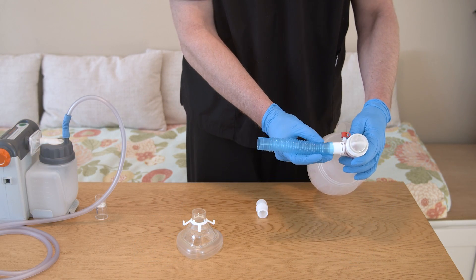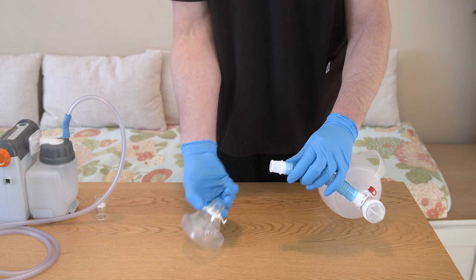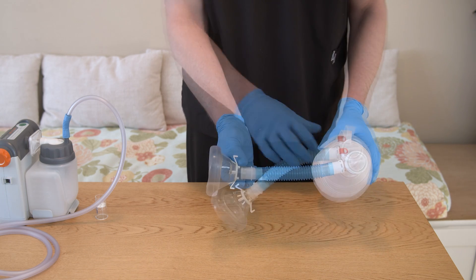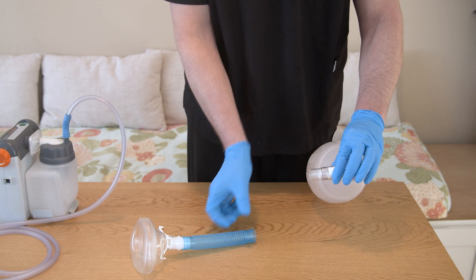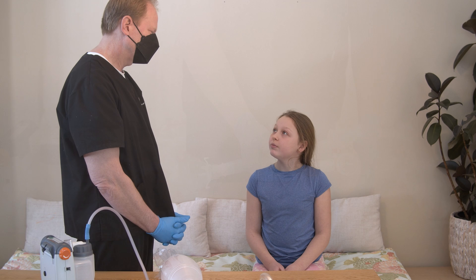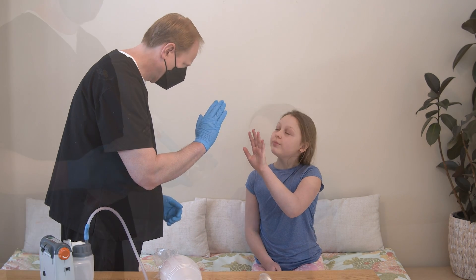Starting at the resuscitation bag, assemble the extension tubing, adapter, and mask. If you are using a one-way valve, place it between the resuscitation bag and the extension tubing. If your child can communicate, figure out a signal that they can use if they need to stop the session.